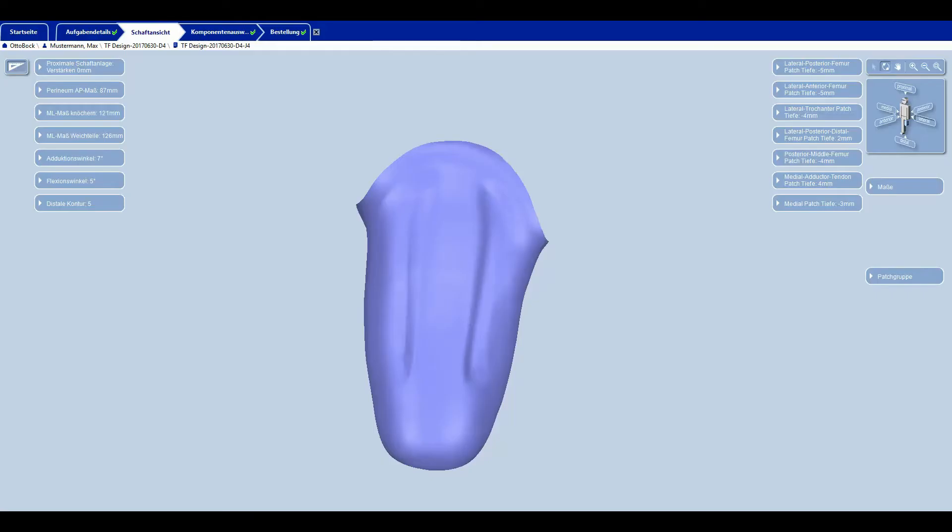A three-dimensional view of the calculated prosthetic socket can be seen in the socket view tab. This can be custom adapted for an optimal fit.